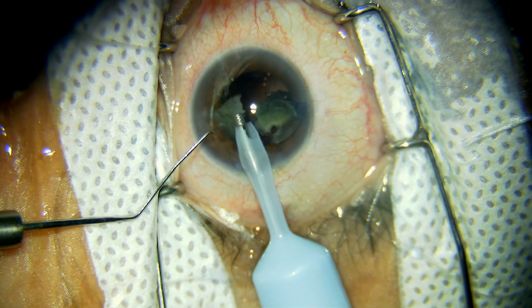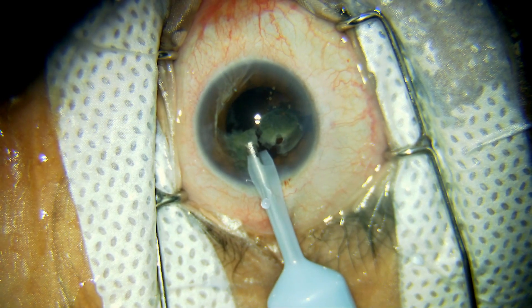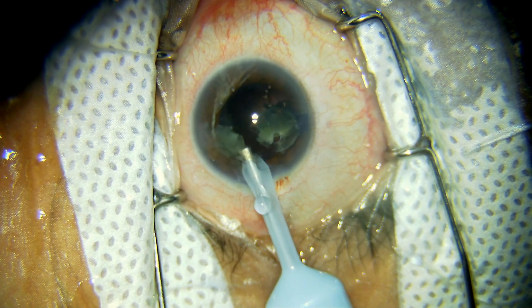Because of the fluid current coming out from the wound all the time, all the fragments will come towards your tip instead of going into the vitreous.